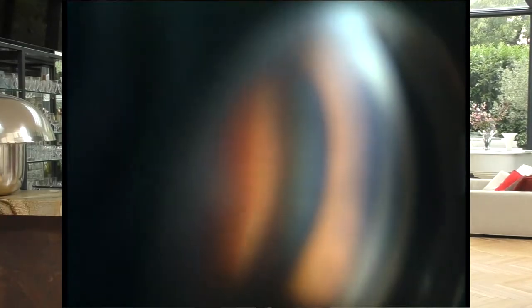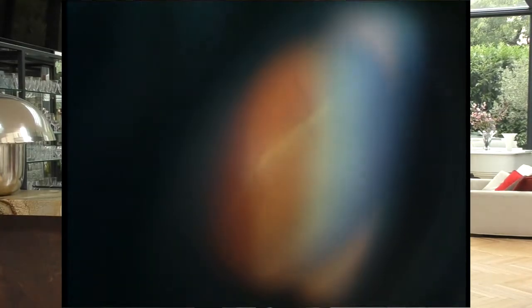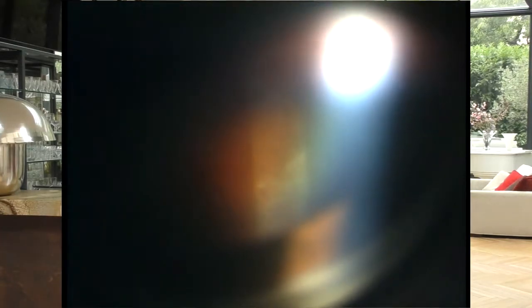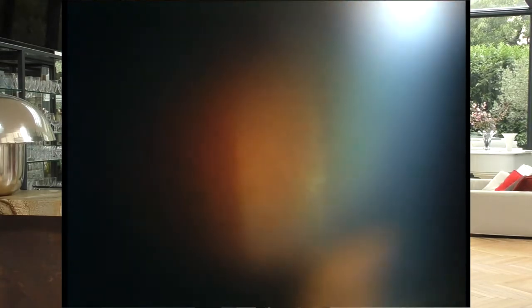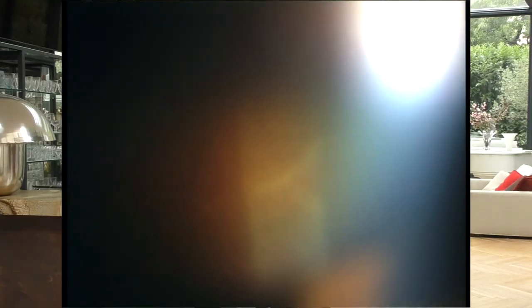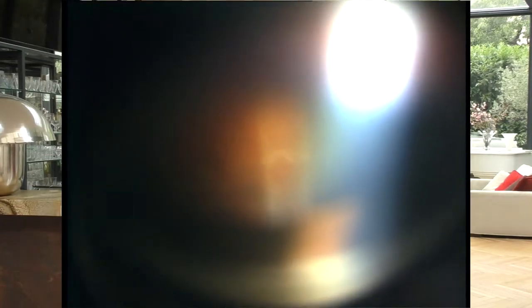I'm going to start at the level of the connection between the detached and the attached retina, focusing on recognizing whether the detached retina approaches the pars plana with an acute angle, sometimes even asymptotic, or on the contrary, with a right angle, even obtuse. Then I examine the detached retina and especially look at these small white details highlighted by the optical section of the slit lamp.